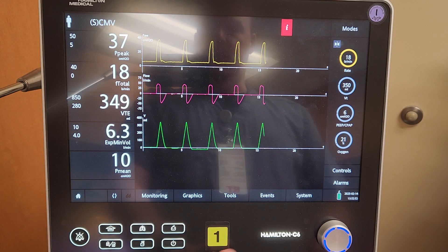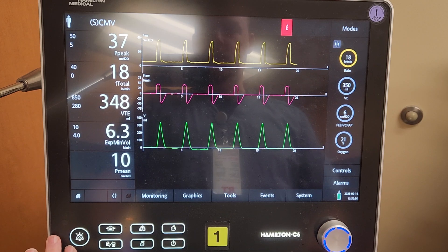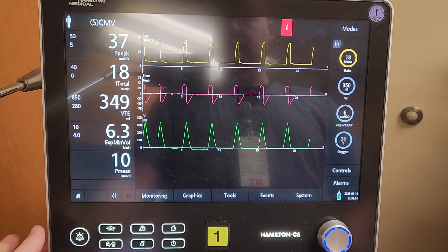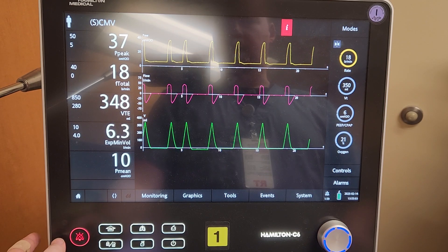Over here on the front of the device, don't be too afraid of any of these buttons, because nothing here will actually hurt the patient. Here you have an alarm silence button — this will silence the alarms for two minutes.